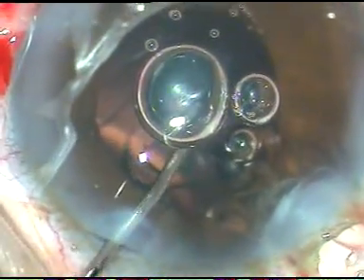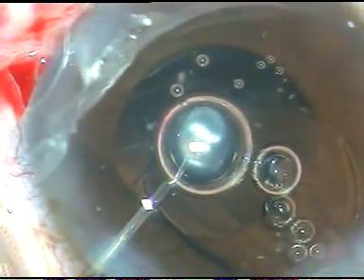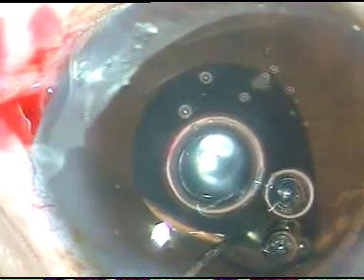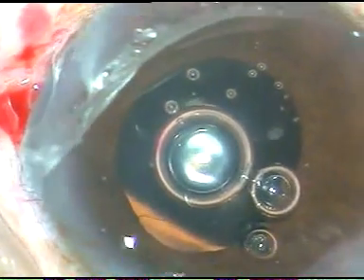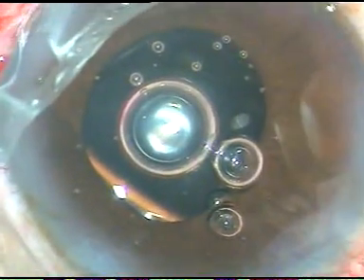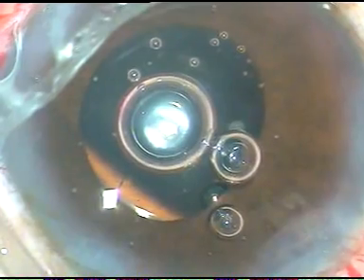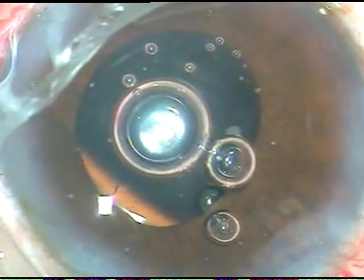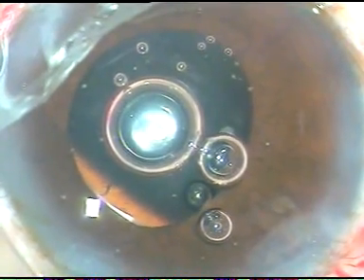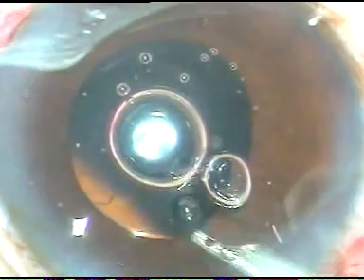Now I take help of the large capsular flaps of the anterior segment, anterior capsule, to place the IOL in the, I should not call it capsular bag, it is behind the anterior capsule.